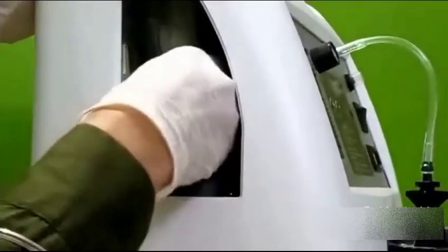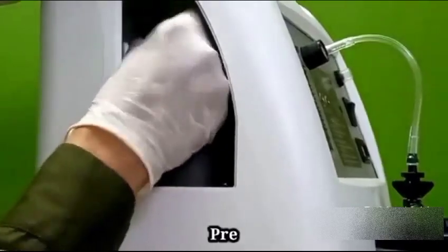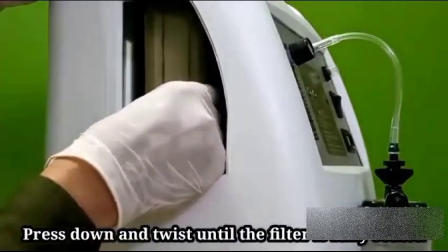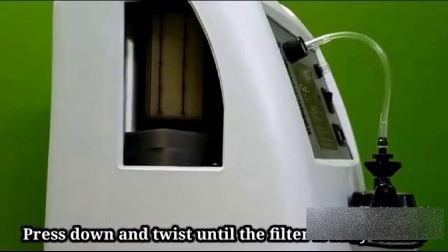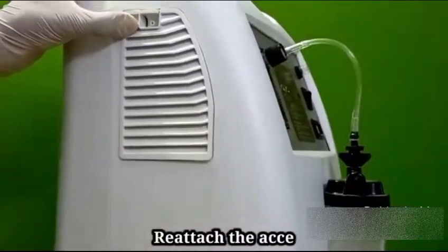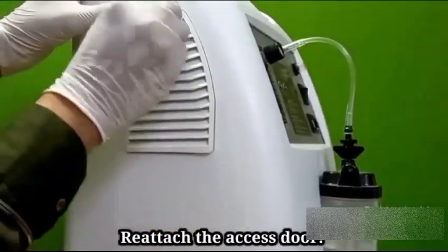You will fit it back in the way you can see. You have to repeat the same process now. You have to press it downwards. When you press it like a snap, it will fit. We will reattach the side cover just as we removed it earlier.